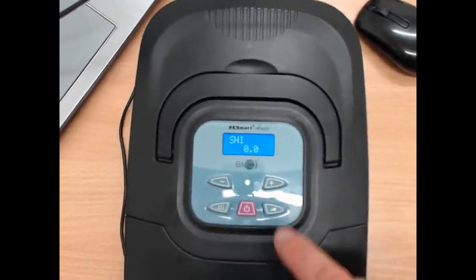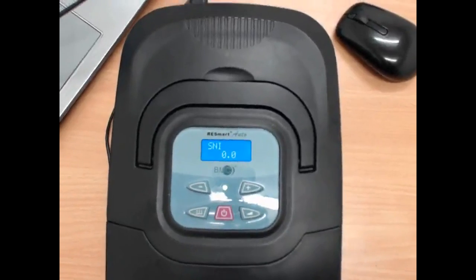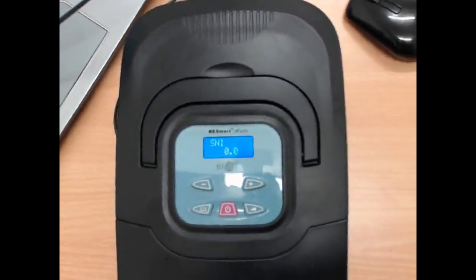Alright, so that's a cool way you can just look on the screen when you wake up in the morning and see, what was my apnea-hypopnea index? How many times an hour did I stop breathing? If it's a bit high, we can adjust certain things with the pressure to try and make it lower.